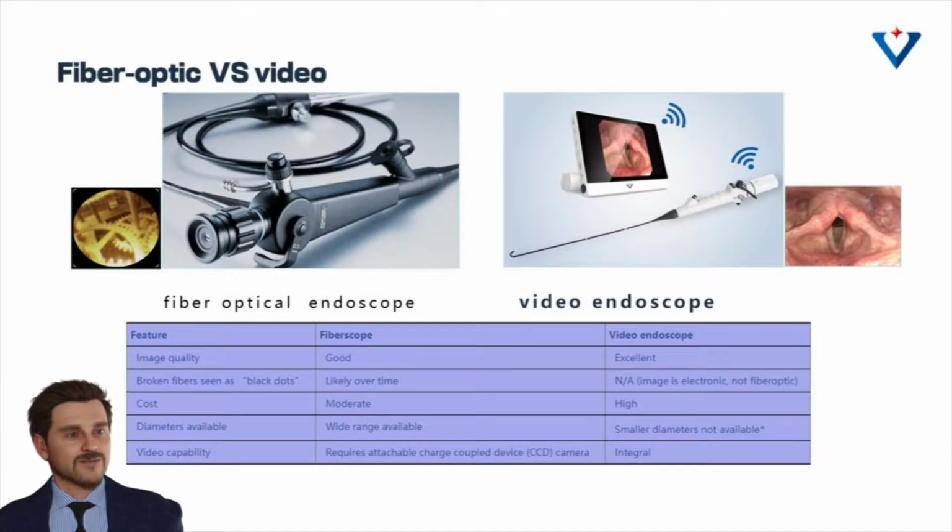Unlike a fibroscope, a video borescope consists of a miniature video camera attached to the distal end of the insertion tube. The camera is designed to capture a digital image. The captured video signal is then carried through the insertion probe to the video display unit. Cost of repair.